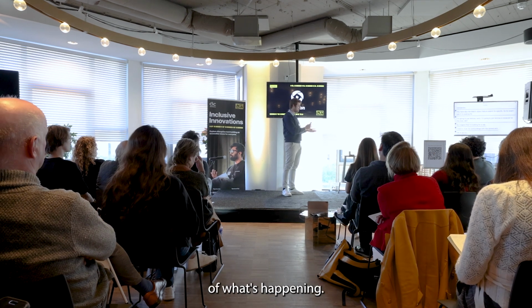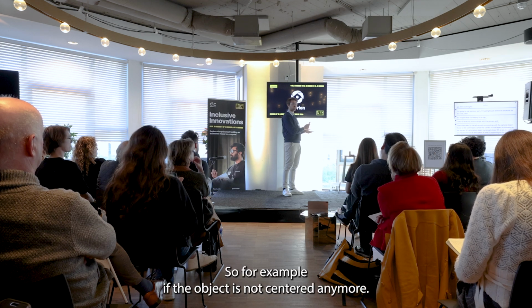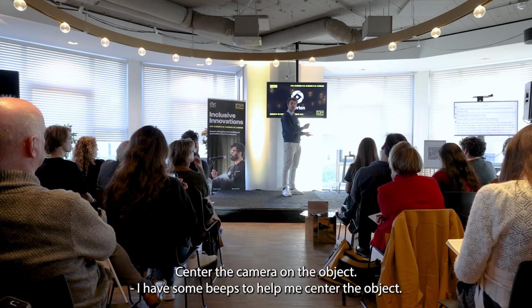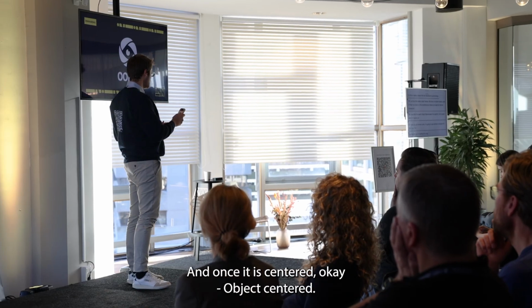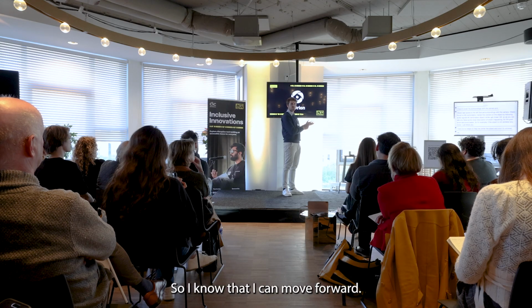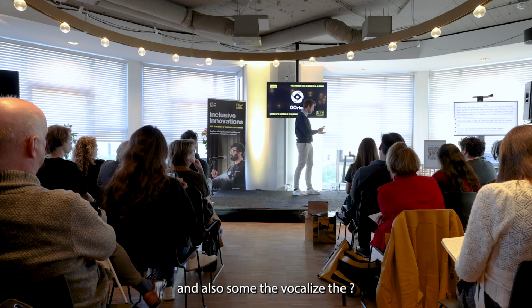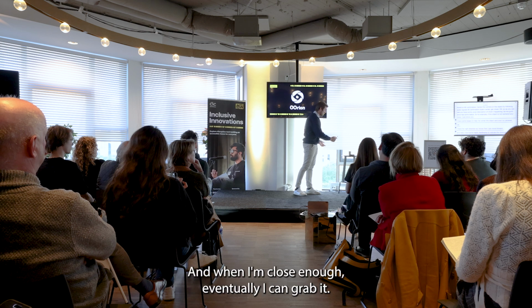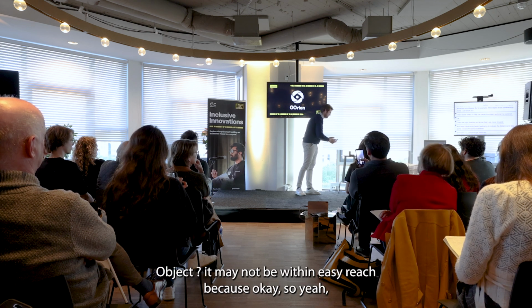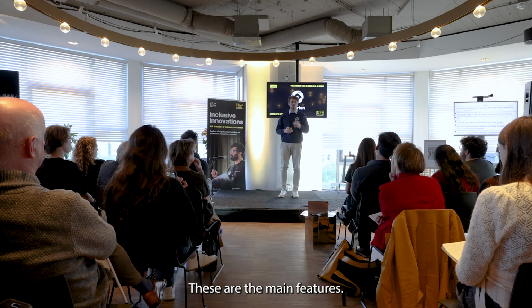Vocal description of what's happening. So the guidance has some beeps. For example, if the object is not centered anymore, I just show you. Focus the object. Aim the camera at the object. I have some beeps to help me center the object. And once it is centered, okay. Object centered. Get closer. I have the right direction, so I know that I can move forward. And here I have some haptic feedback to indicate the distance, and also some vocalized sensory cues. And when I'm close enough, eventually I can grab the object. It may not be within easy reach. Be cautious. Okay. So yeah, these are the main features.